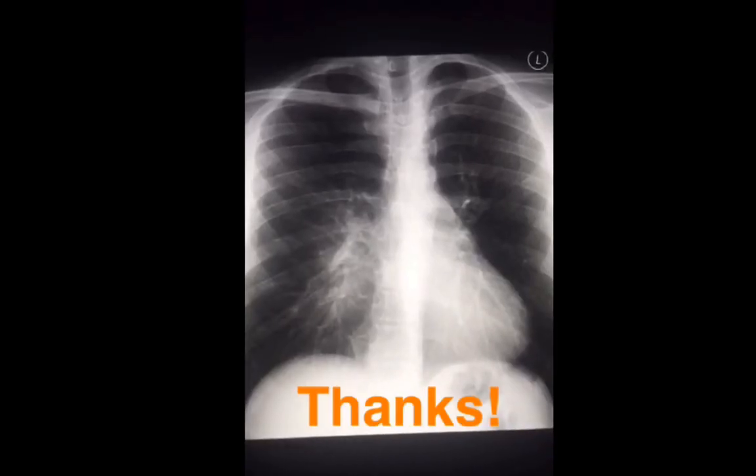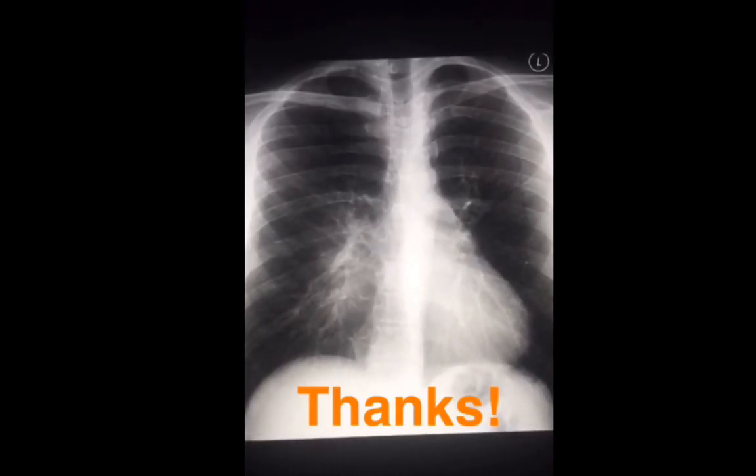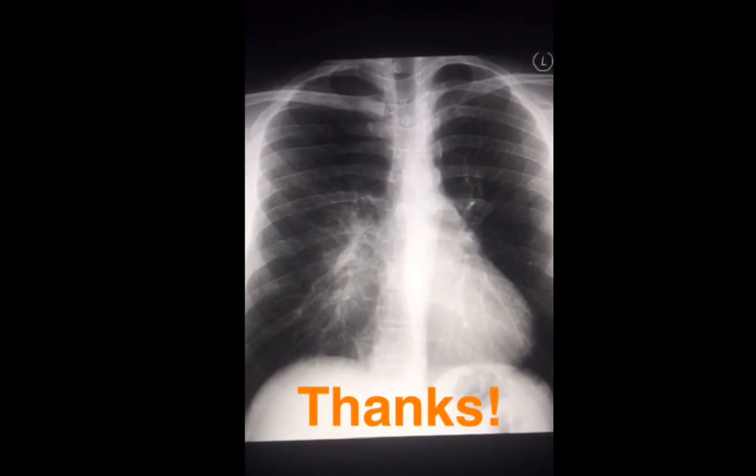We learned today that pectus excavatum may mimic right middle lobe pneumonia or collapse, and we also learned how to look for secondary signs of this condition.